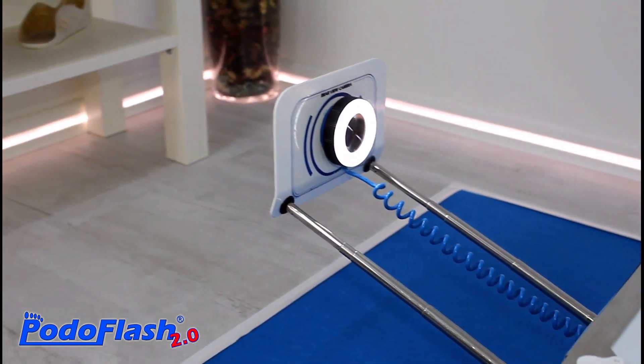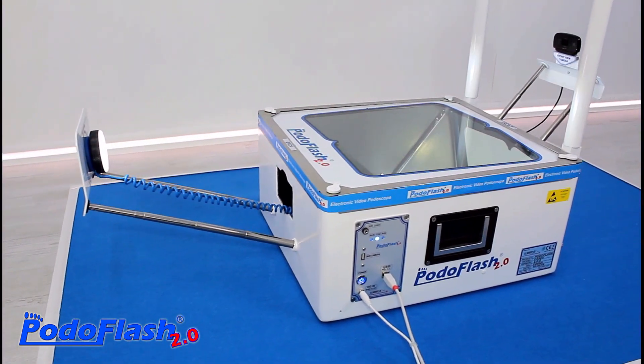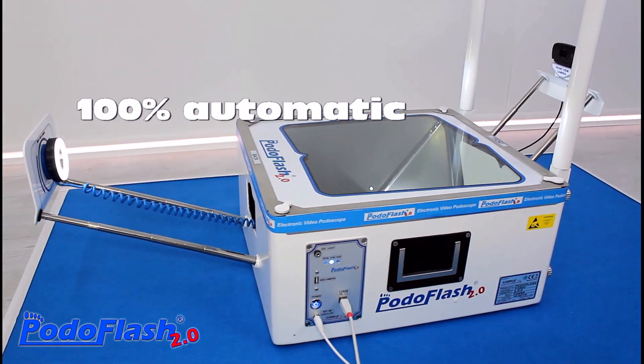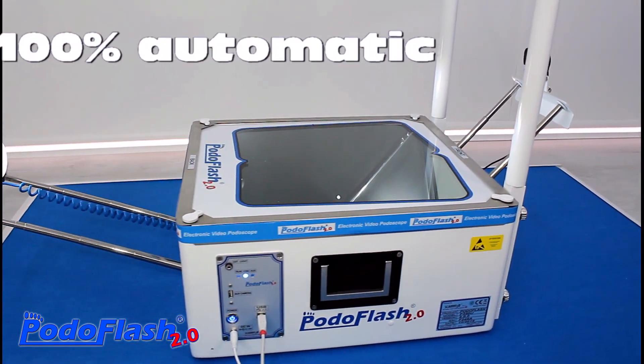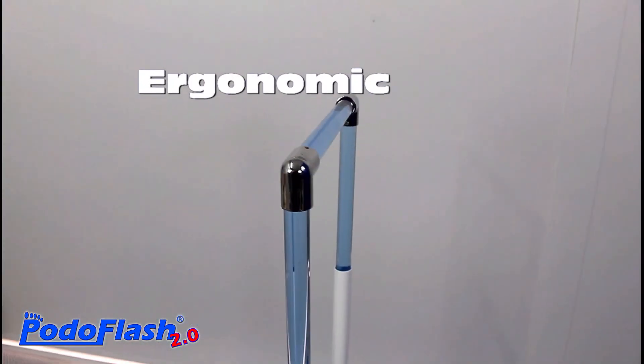The ease of use, the speed and the measurement accuracy, together with the innovative and ergonomic design, make the Podoflash an essential device for the podiatrist in the diagnosis of structural and functional foot anomalies.